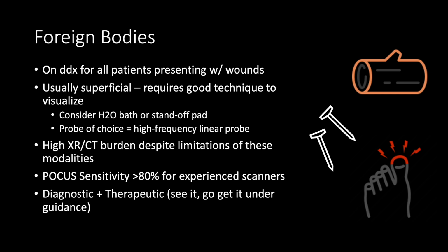In the primary care and emergency room settings, radiographs or CT are often used to identify the nature and location of foreign bodies, but these modalities have limitations on what they can visualize, and X-ray in particular can leave us guessing where exactly the object is in 3D space, unless we take multiple radiographs and use stereotactic pins or markers to help guide our anatomy.